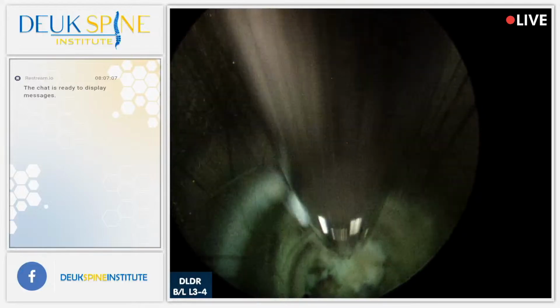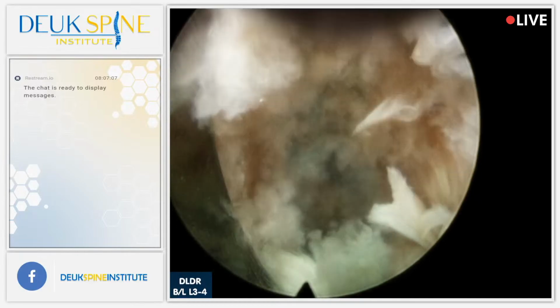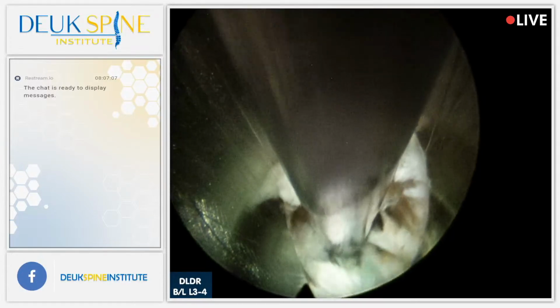I'd say just about 2 more minutes on this disc on this side. And then we're going to switch sides. I'm going to come over there to do that side, Luis. Yes, sir. Yeah. Very nice. You can see the inside of the disc right there. Any questions from our audience?